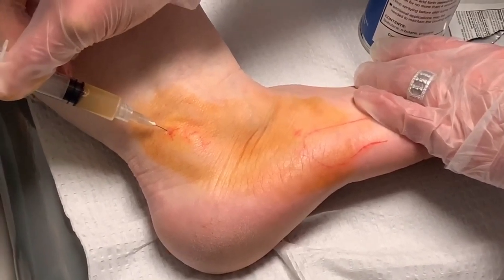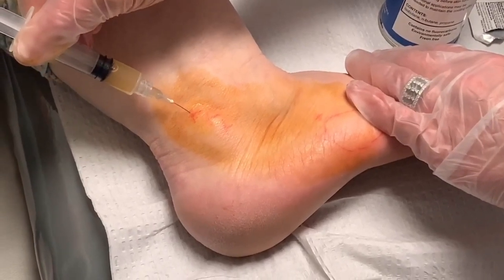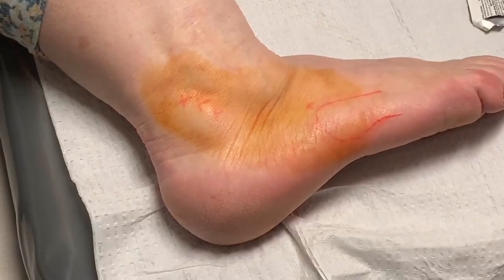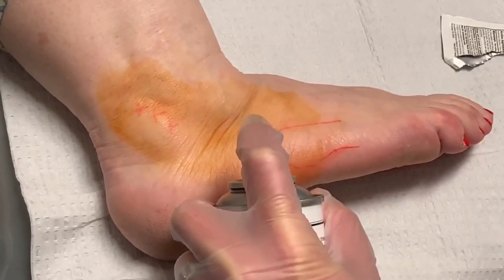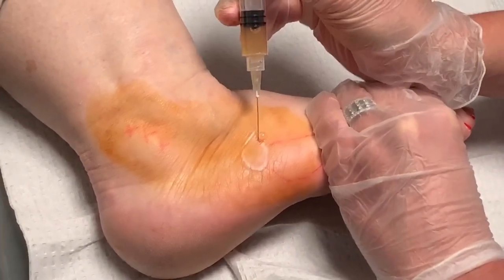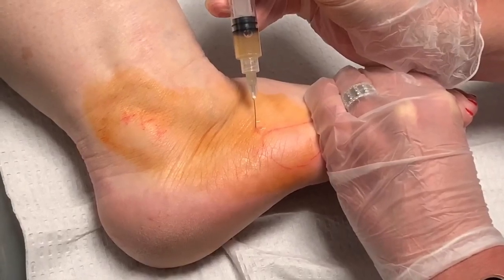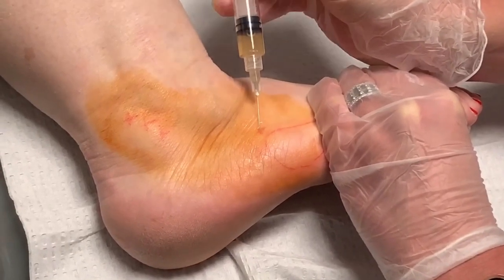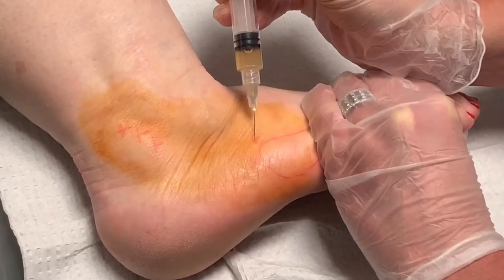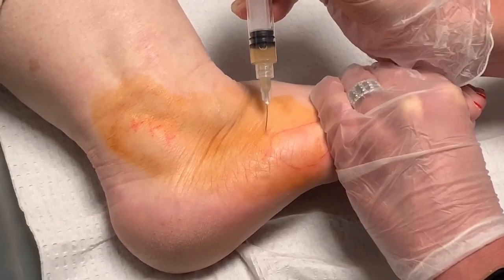I'm going to go right in there. Okay, we're almost there. One spot down, one to go. Here we go on the second one and then you're all done. This is also a common area where you can get a tear. This tendon is commonly injured with a severe ankle sprain, and a lot of people would think it will just go away. Just breathe through it — we're almost done.